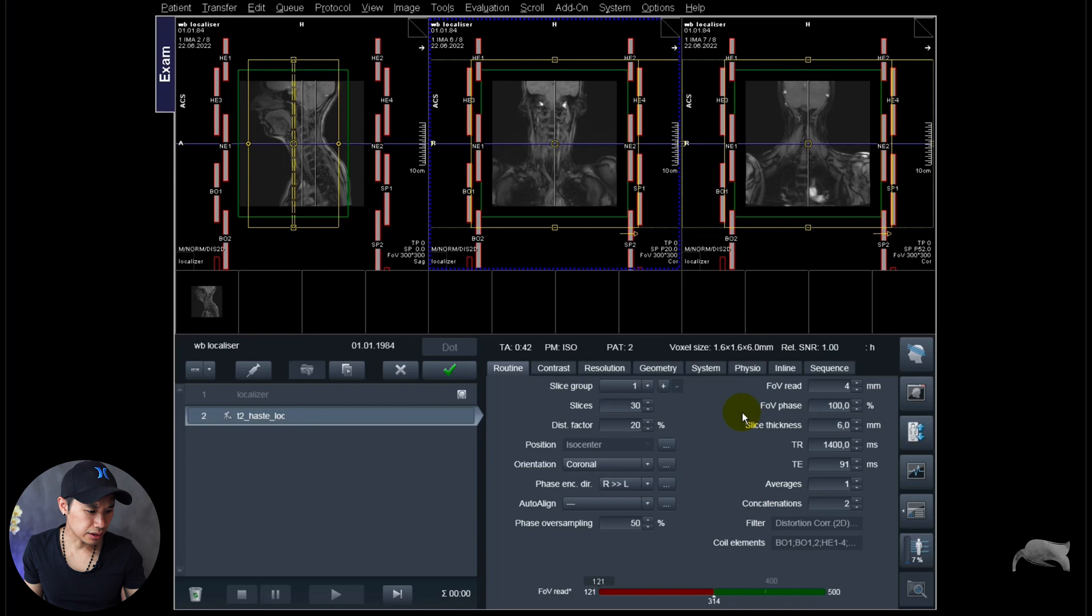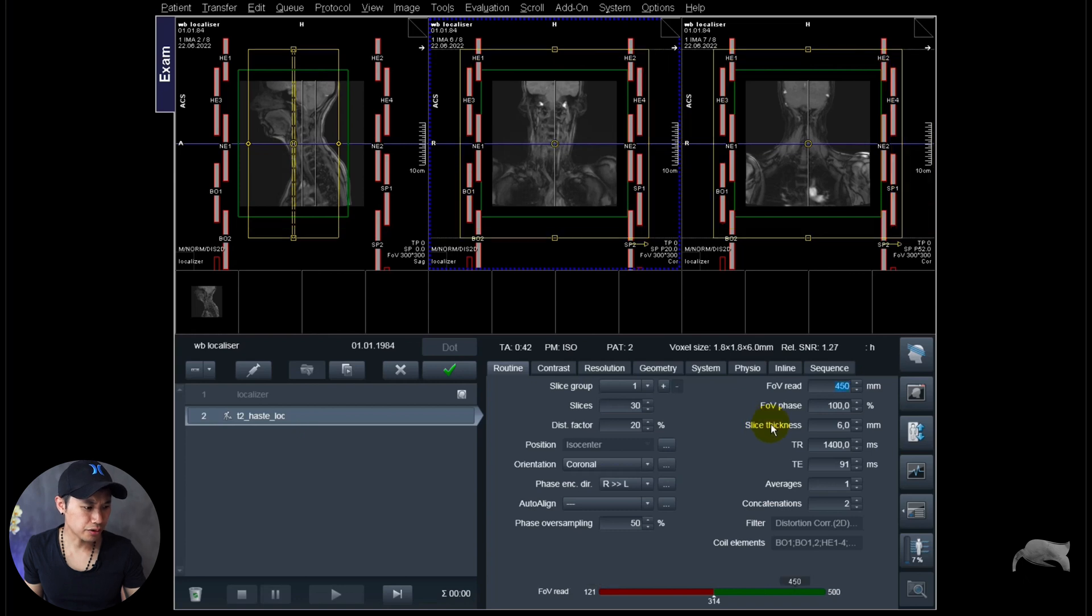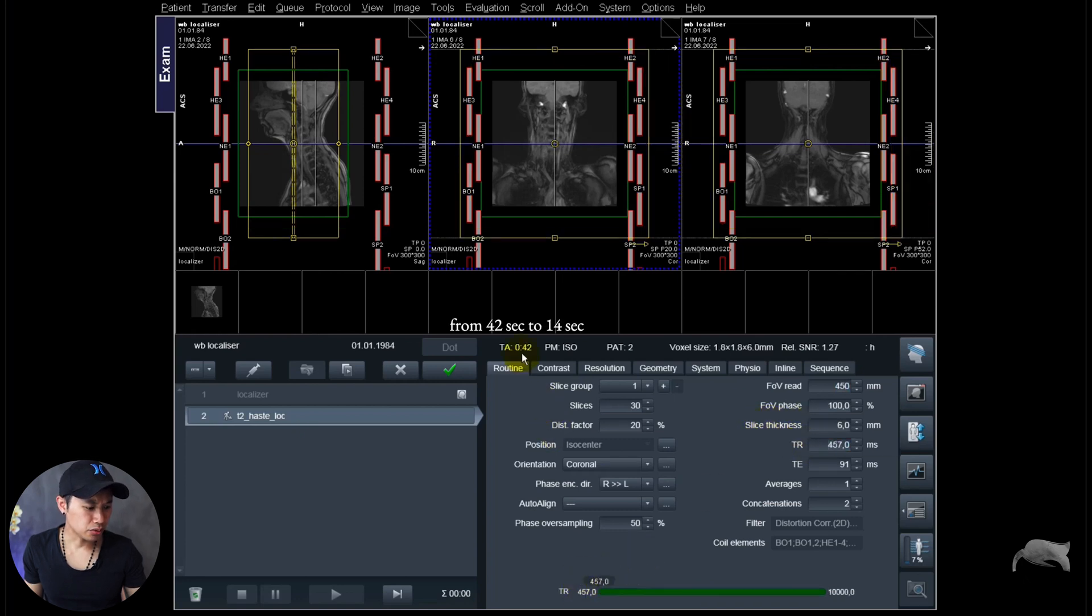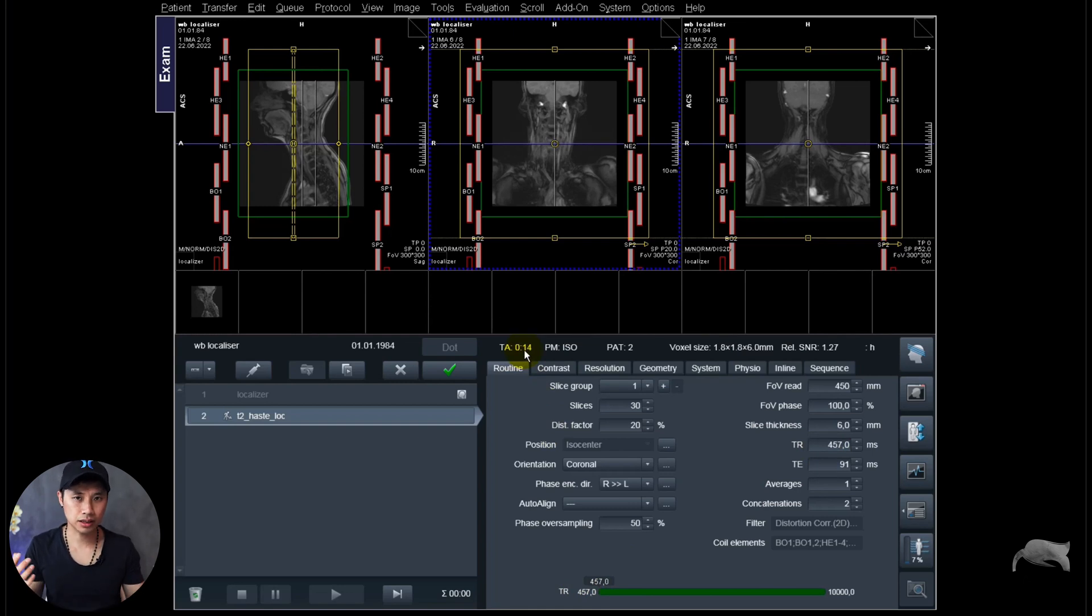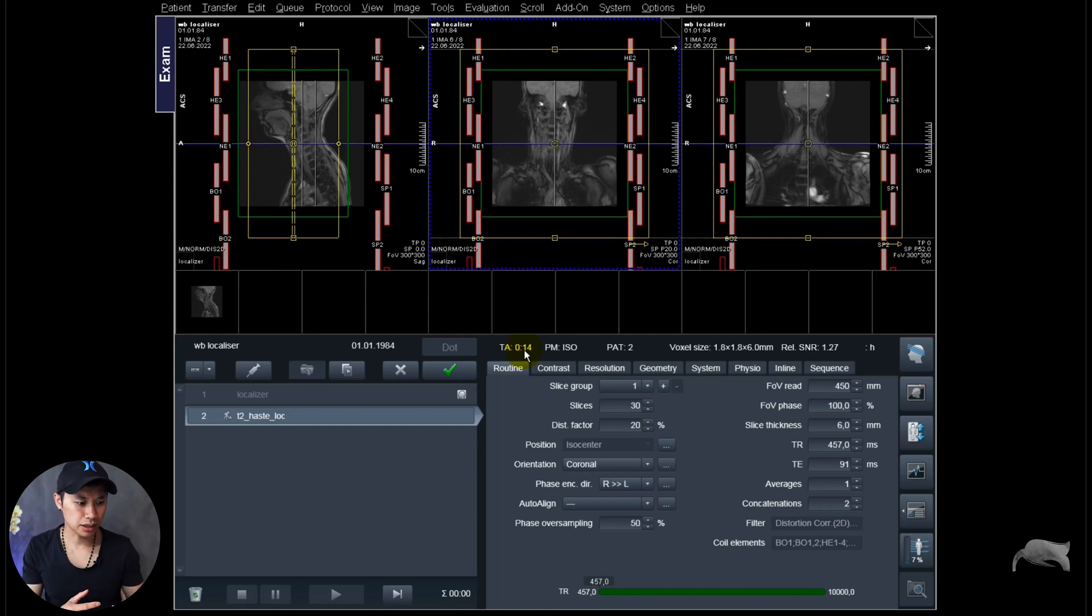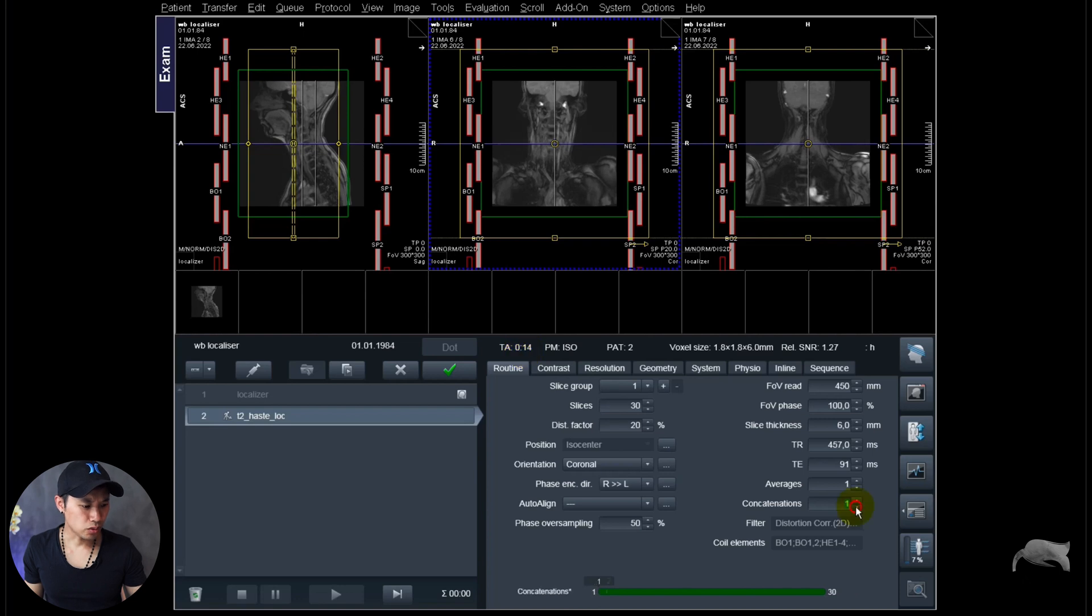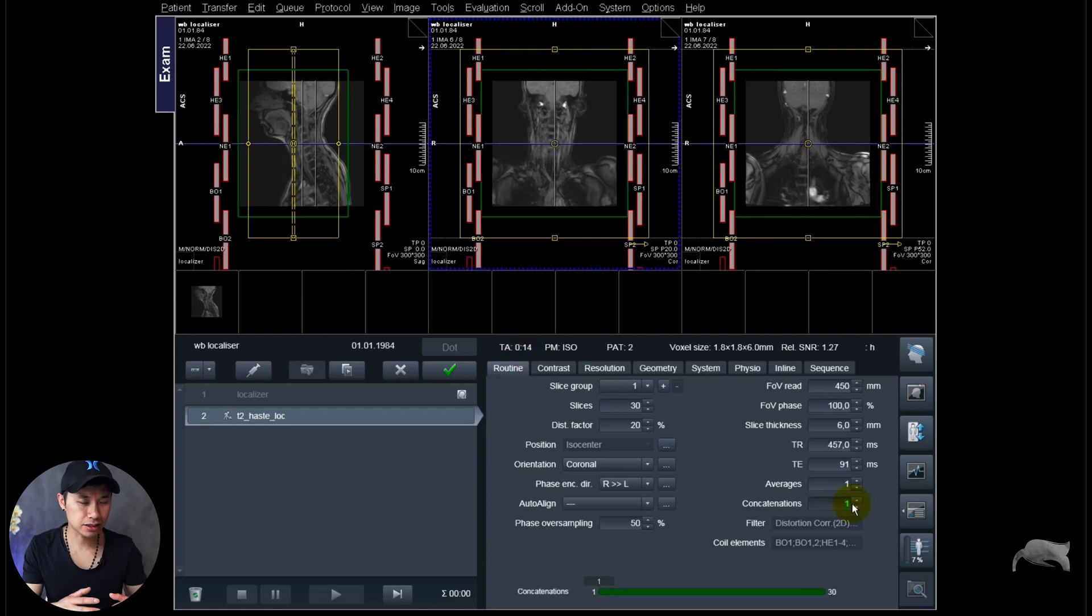Let's check, we're going to have a little bit bigger field of view, 450 millimeter, and I will put the TR to as low as possible. I still will have a good T2 contrast because it's a HASTE. So it's not every other sequence, so it's a HASTE, so you can have a low TR so I will save time already there.